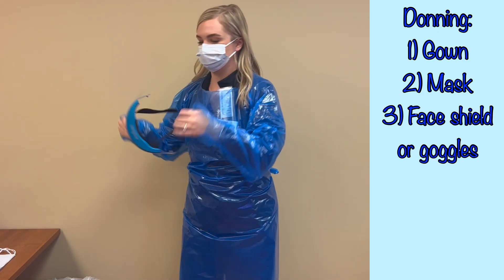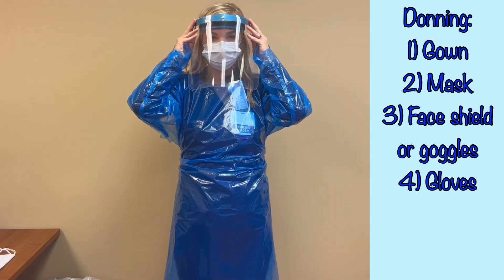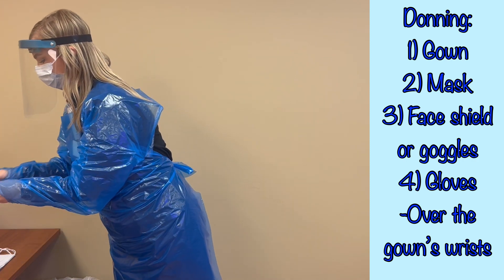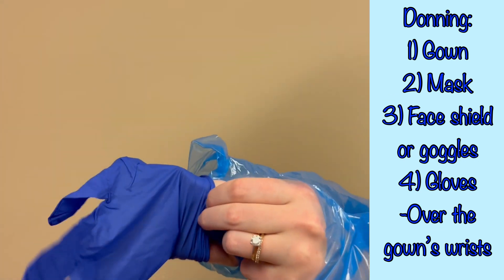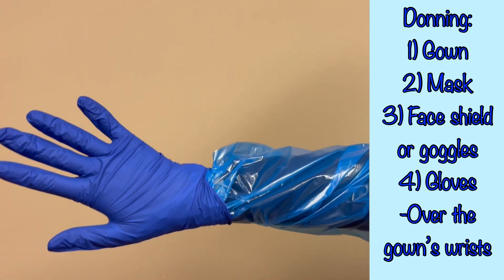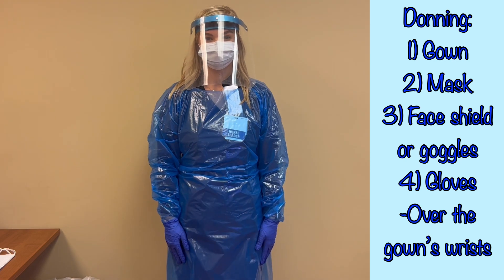Thirdly, put on the goggles or face shield. And finally, apply the gloves. The gloves should extend over the wrist of the gown. With this disposable gown, this is easily achieved if you have your thumbs in the thumb holes, as seen here. But regardless of what type of gown you are wearing, the wrist of the gown should be underneath or inside of the cuff of the glove. Donning in this method ensures you are adequately protected while caring for the patient.